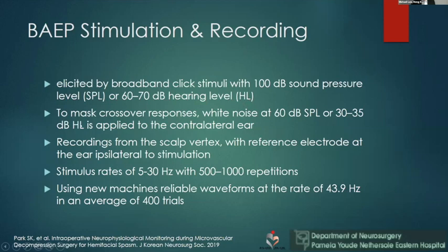And we also use the mask response using the white noise applied to the contralateral ear. And for the recording, we record at the vertex as well as the ear ipsilateral to stimulation.